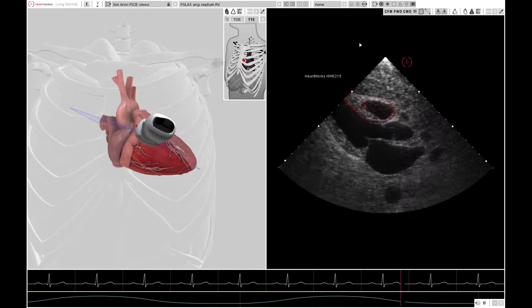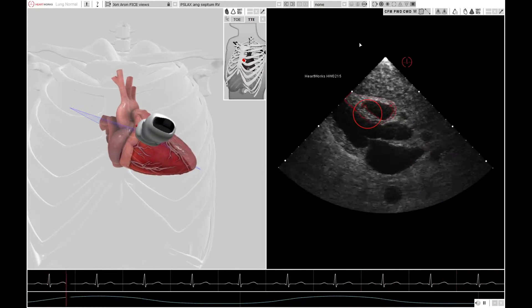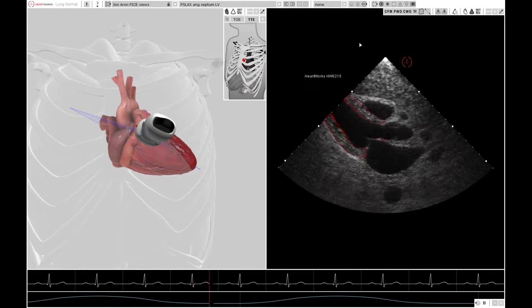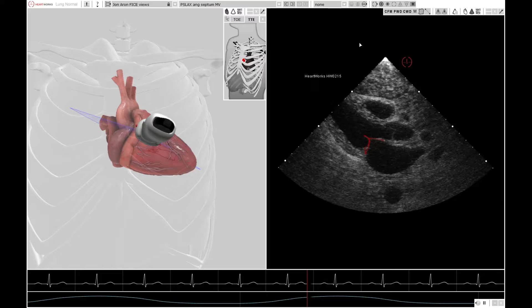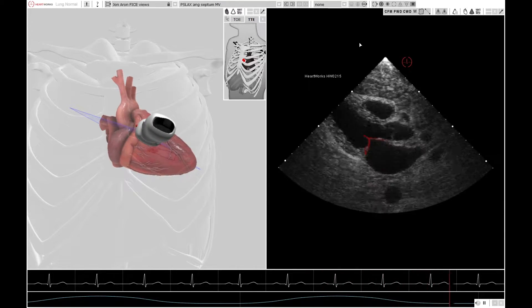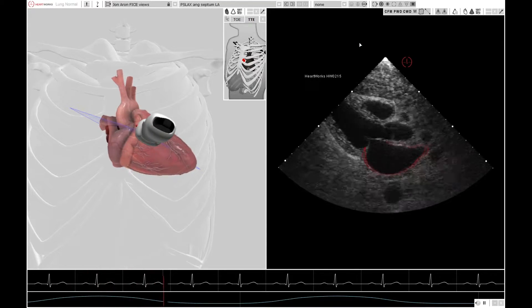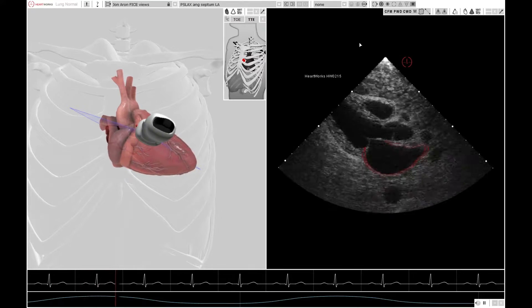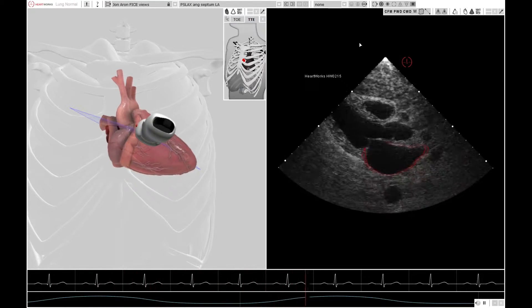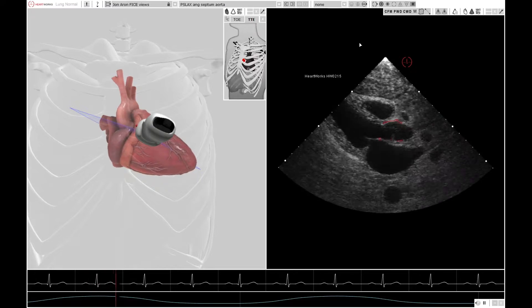Most anteriorly is the right ventricle, highlighted there, and the septum, which separates the right ventricle from the left ventricle. To the bottom of the image you have the inferior lateral wall of the left ventricle. The aortic valve can be seen quite clearly — you see two out of the three cusps — and you also see the mitral valve, ideally both valve leaflets. The left atrium is also present and should form around a third of the depth of the whole heart, the other two thirds being the left ventricular outflow tract and the right side of the heart. You can make a judgement on whether one of these structures is enlarged in this view. The aortic root can also be seen.